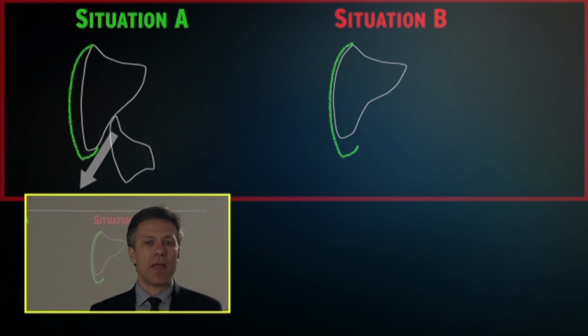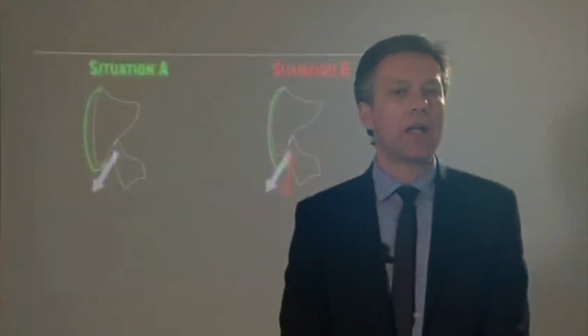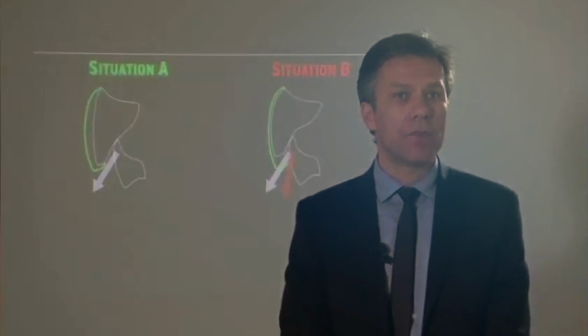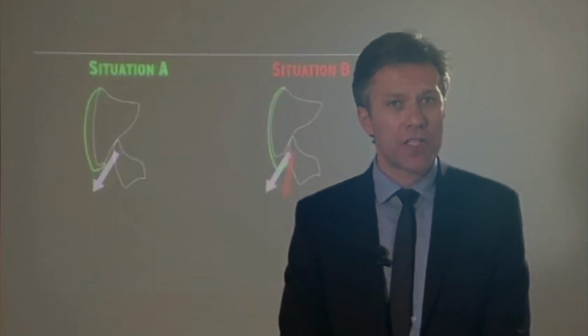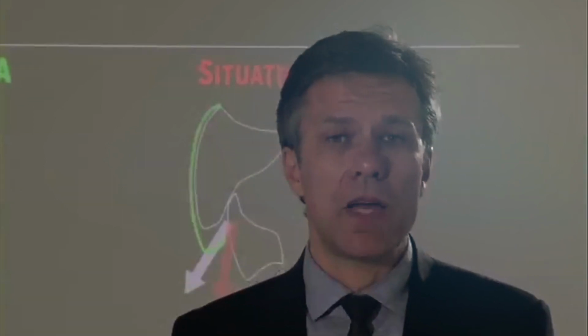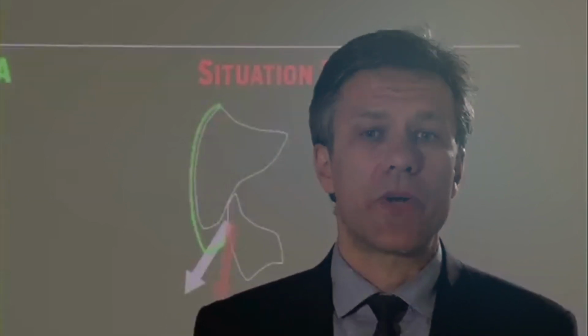But sometimes, depending on how much you increase on the incisal edge, you steepen the guidance, and this guidance will be very inclined, and this inclination leads to torsional force, leads to forces on the ceramics that can make the ceramics not last too long. So we create a problem depending on how much we are increasing the length.